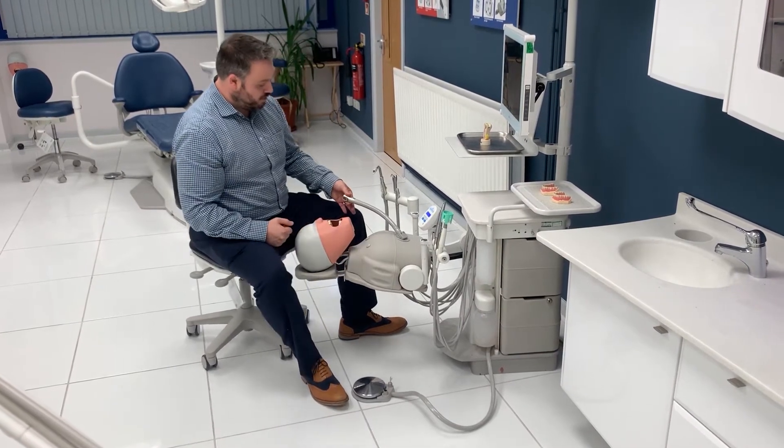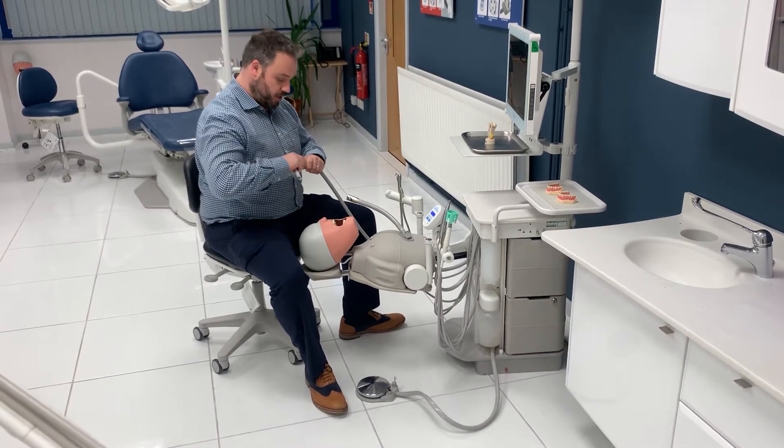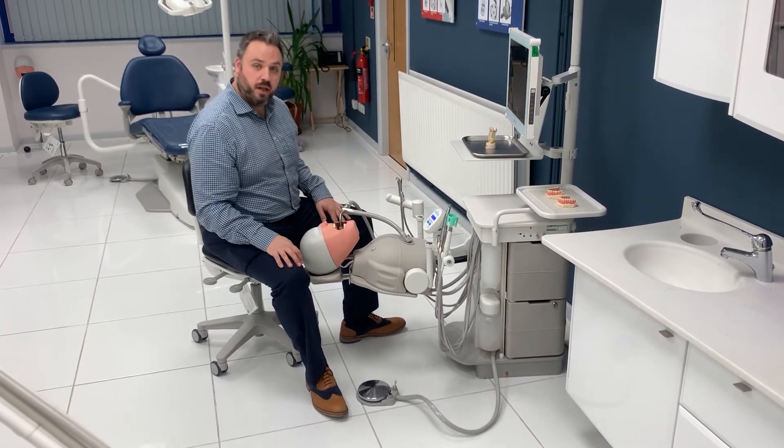If you want to use the third arm to simulate a realistic suction position, you can select your suction handpiece, insert one end through the third arm, and attach the suction from there, and place that into the mouth.